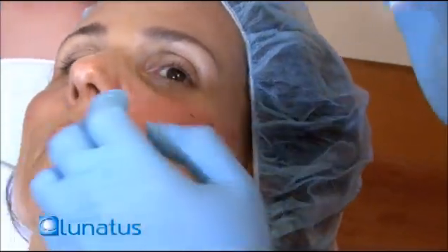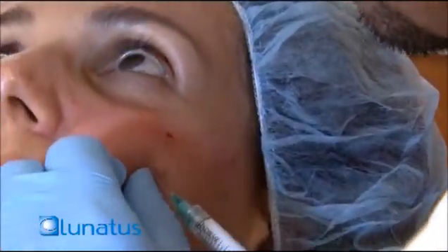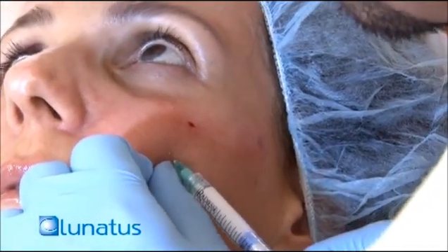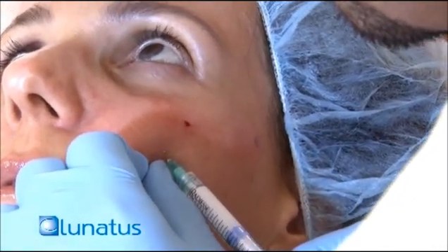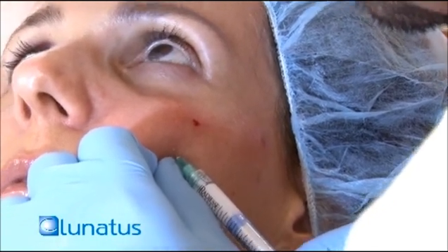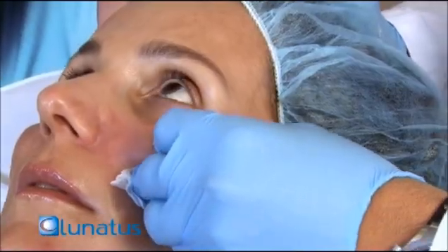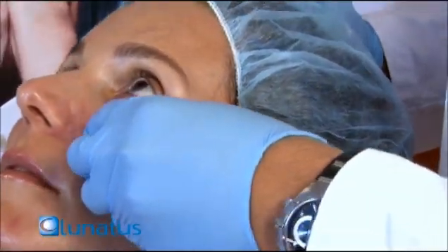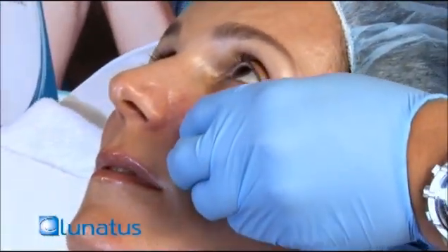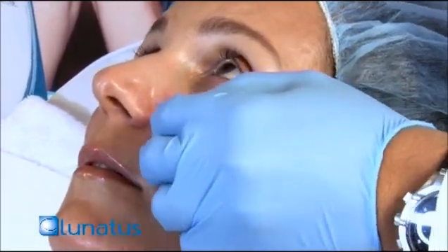I'm going to move her. I see that there's a little defect right over there. I'm going to put my bolus right where the zygoma is. Feel the bone, just a tiny amount. Give it a little good bolus push. So we've done her cheeks, only 2 insertion points, and like I said, it's mainly the bolus push technique. So we put the bolus in, and we're going to try to push it up a little bit. We're going to keep on trying pushing it up.